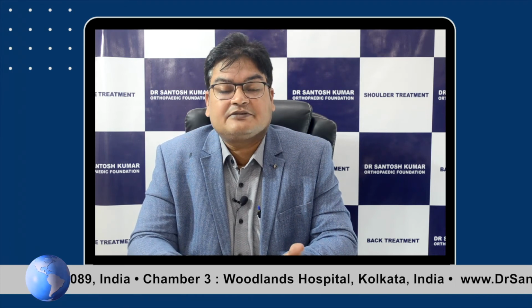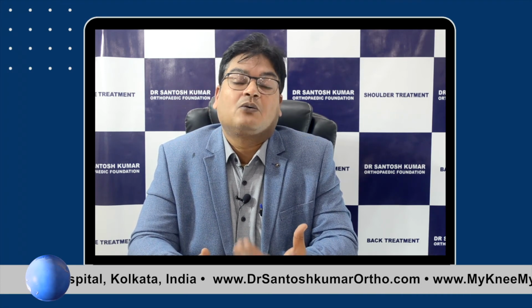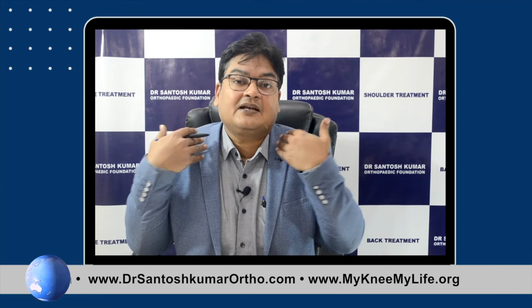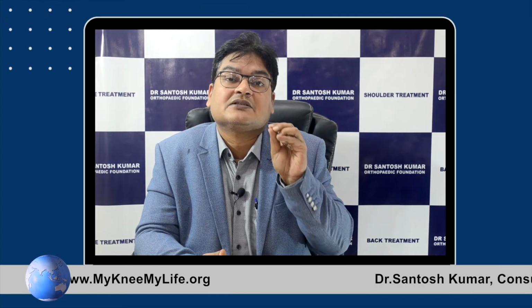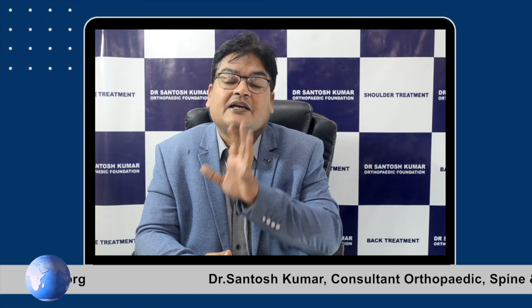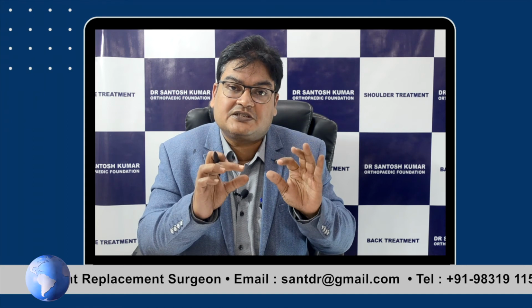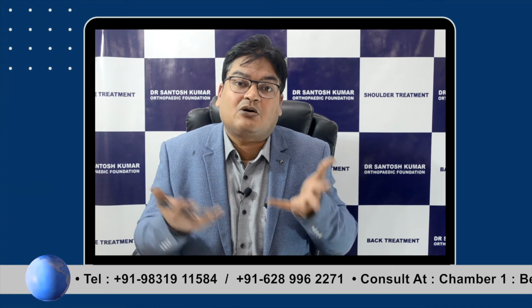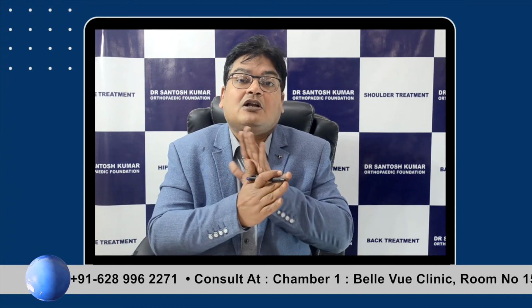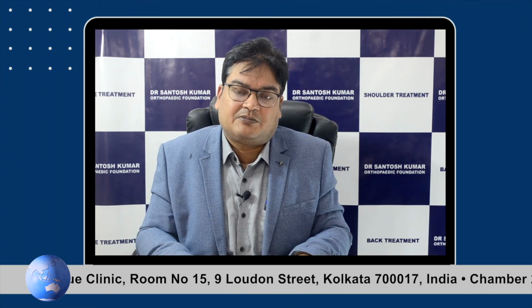So in this video, we saw the problems of the neck, which mainly is protrusion of disc. It causes neck pain and arm pain, and 95% of times it will be cured with time and medicines. We have to give medicines, wait, and it will be cured. But if it is not getting cured, 5% of times it will require surgery. The traditional surgery was to take out the diseased disc and fuse it. That is known as anterior cervical discectomy and fusion. And presently we have moved to cervical arthroplasty also. But of course we have to remember that in all cases we cannot do cervical disc arthroplasty. We have to choose selectively and then only we can do it.